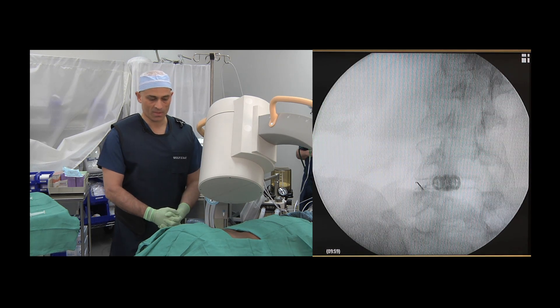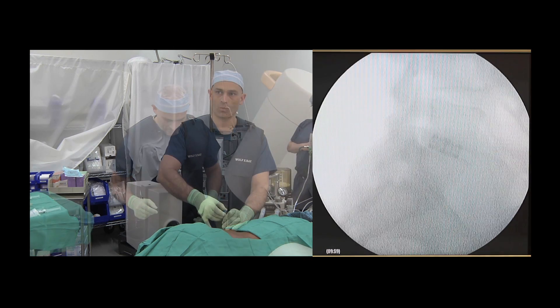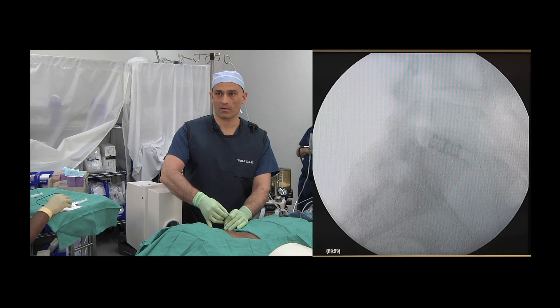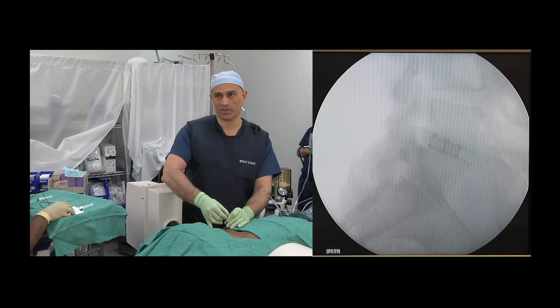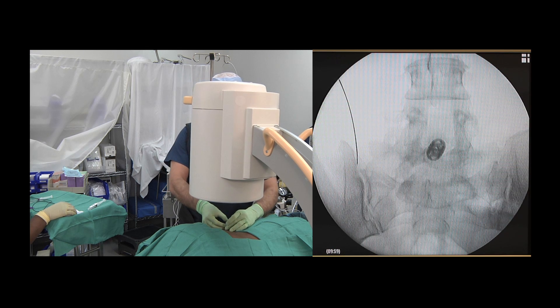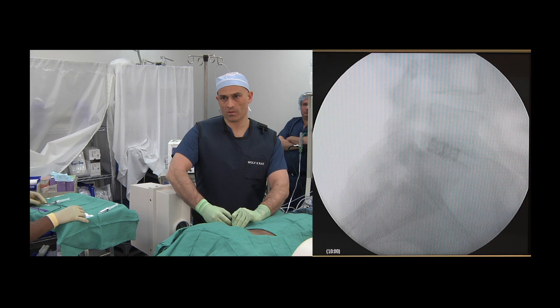The C-arm is rotated into a lateral view, which will allow positioning of the needle in the neuroforaminal space. The lateral view allows precise placement of the needle within the neuroforaminal space.